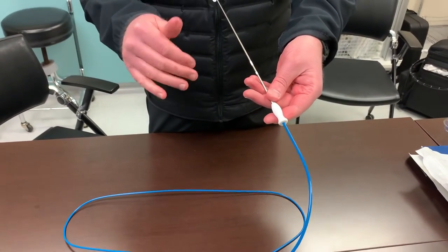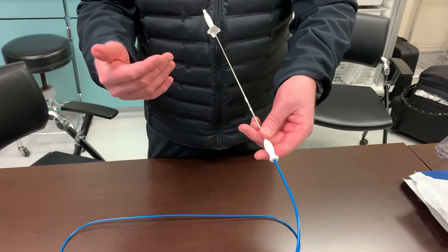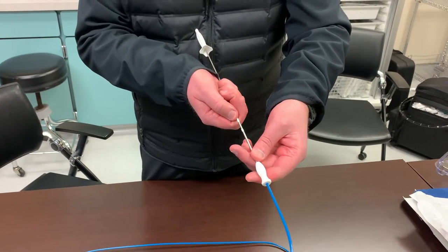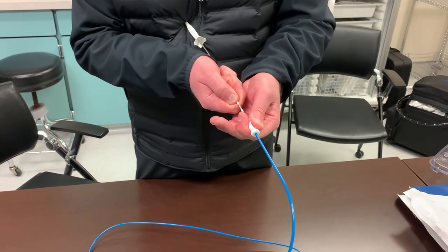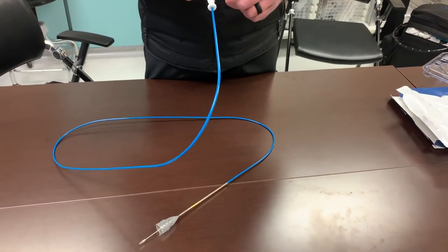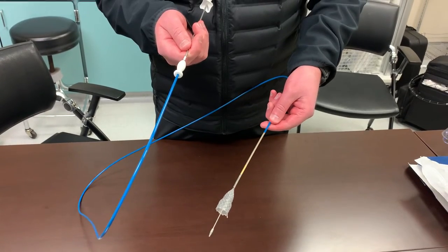This stent, although it's through the scope, also has fluoroscopic markings — there are five markings: the leading mark, the traveling marker, the 50% deployment mark, the point of no return, and the trailing marker. All of those can be seen on fluoroscopic visualization. As you withdraw on the catheter and deploy the stent, for every inch that you deploy here, your physician is going to need to withdraw or pull back on the catheter that same amount to make sure the stent stays in the exact same position.